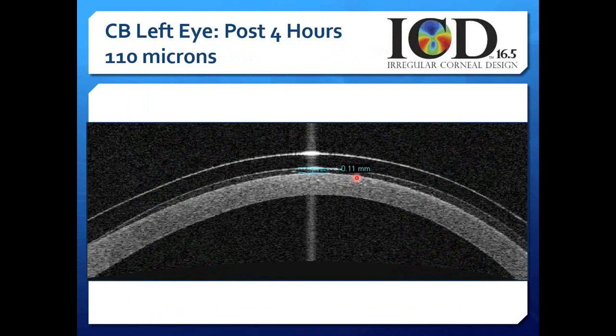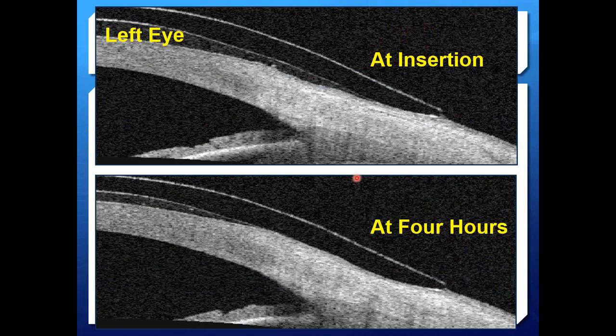Clearly this lens could use more apical clearance, especially if we're dealing with a keratoconic eye where we might have a high point somewhere in the surface, or a penetrating keratoplasty where there's multiple high points. We can look at the OCT on insertion. There's plenty of fluid between lens and peripheral cornea, limbus, and the initial part of the sclera. But after settling on the left eye, it's settled just near the limbus, but not quite into the peripheral cornea. So on the temporal side, it's okay. And again, it's because we often see the lenses riding slightly temporal.